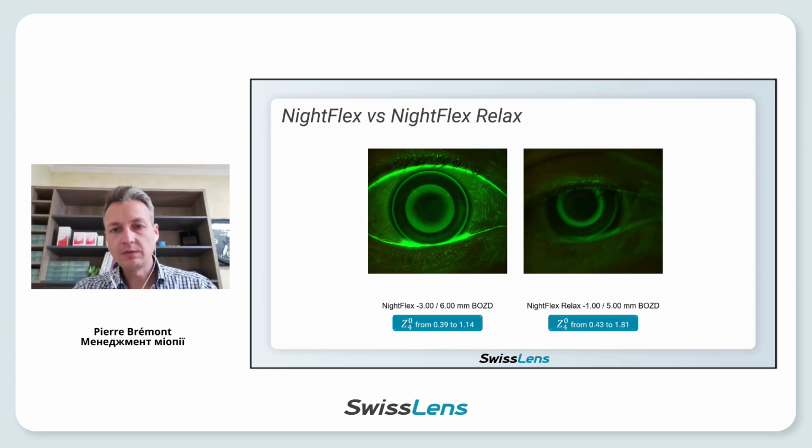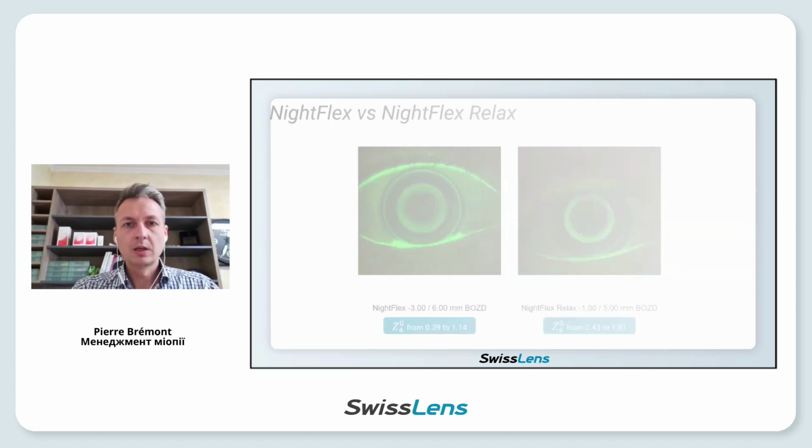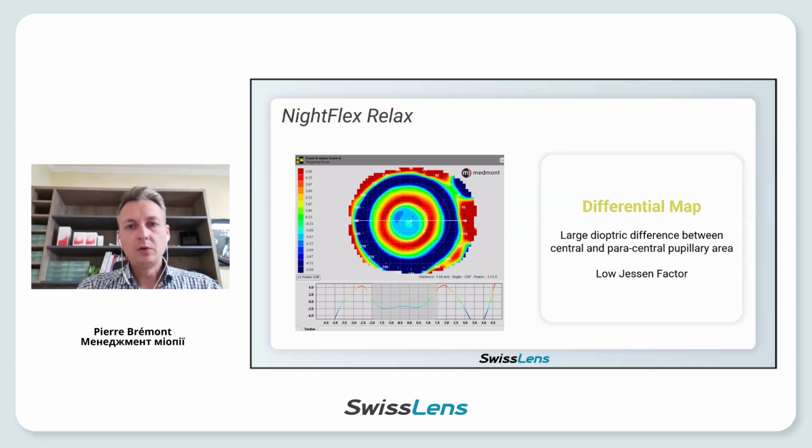So even if the myopia is lower, we can achieve a better spherical aberration in the result of topography, here from 0.43 to 1.81. So really good result. If you look at the differential map, you can measure the dioptric difference between the center and the mid-periphery.